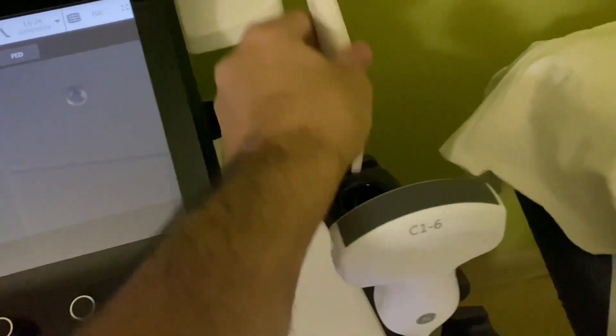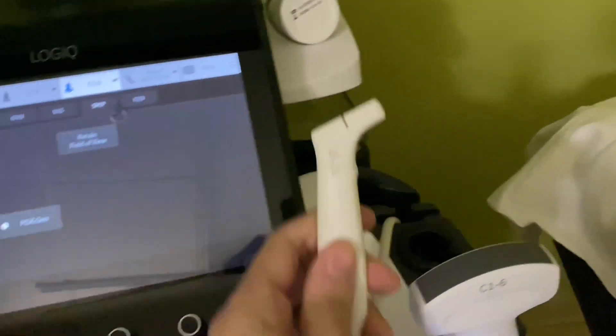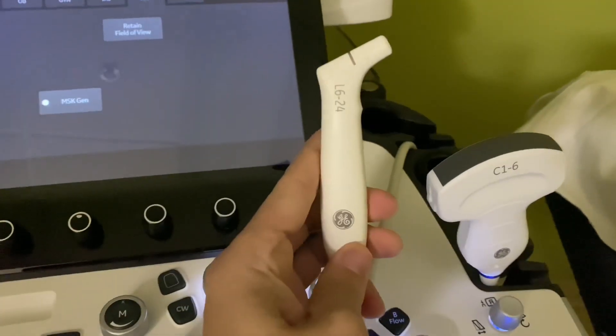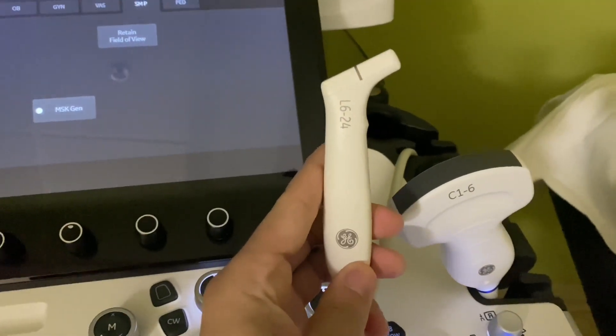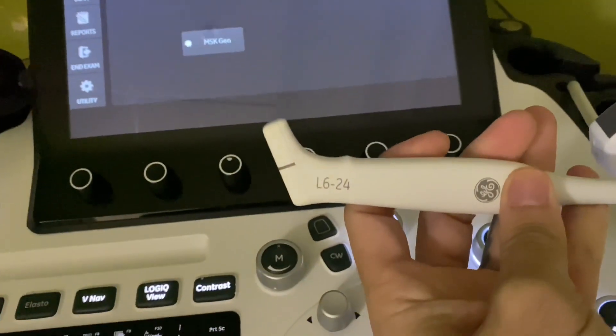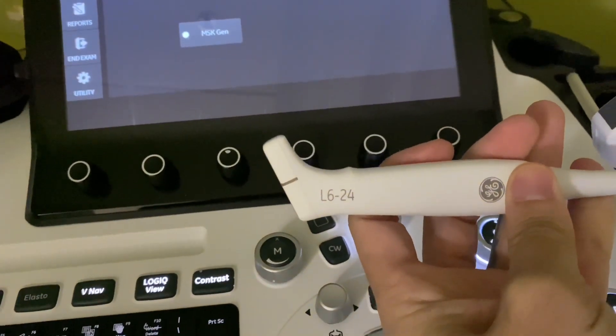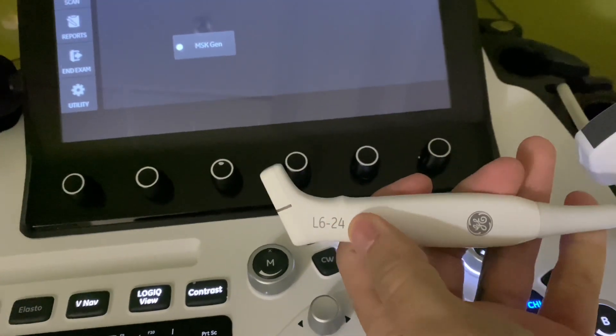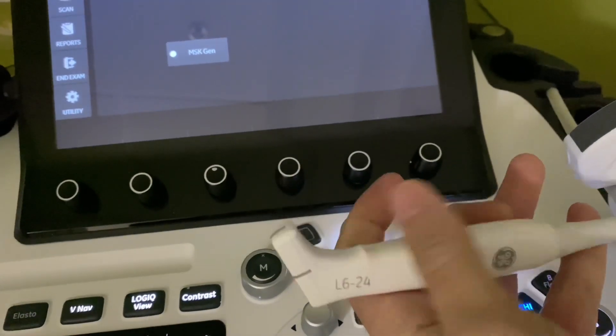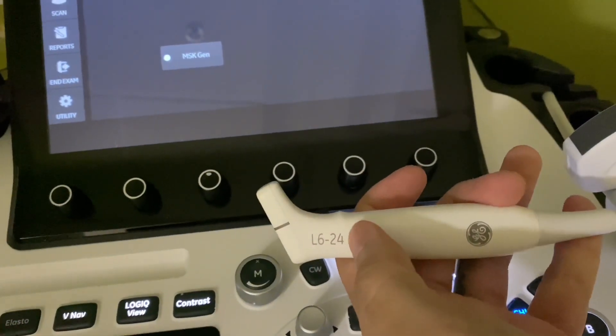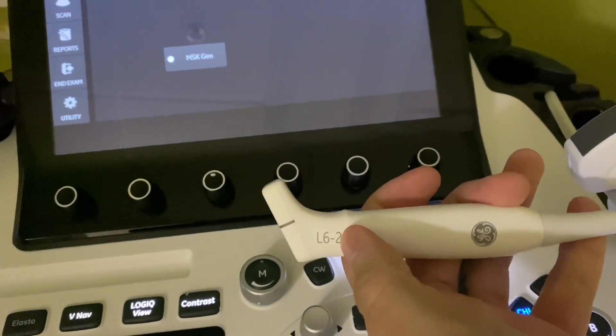All right, new also is the linear hockey stick. The other one used to go to L18, this one goes to 24. I've also used it right now. Here's an example.